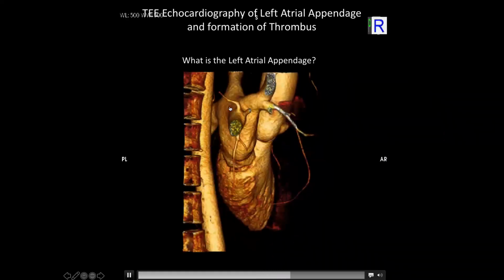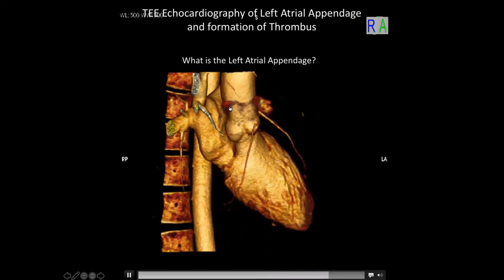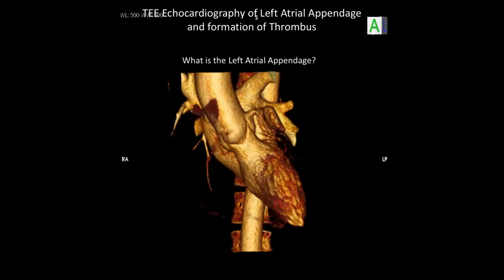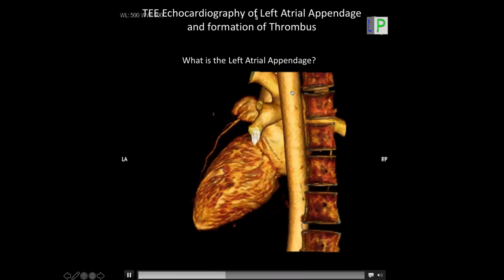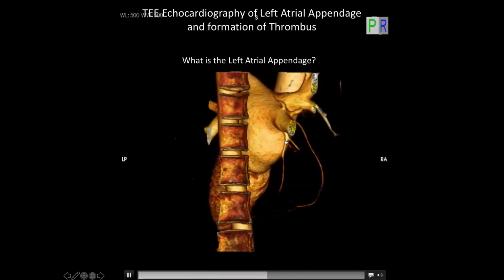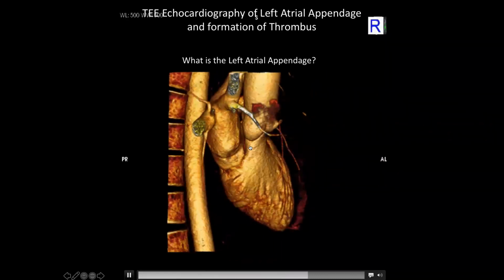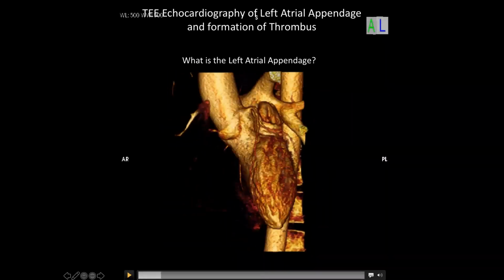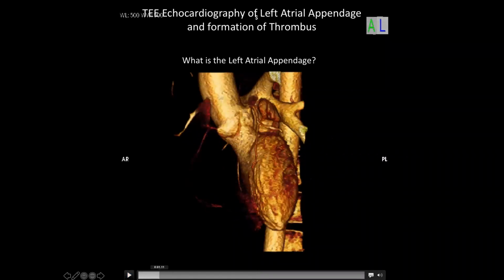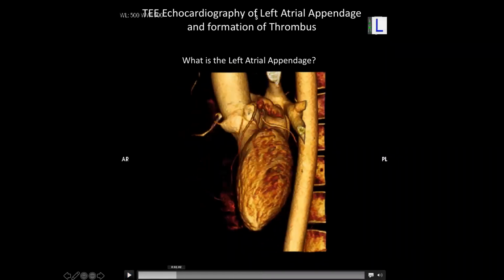So you have the pulmonary veins coming in from the lungs, right? And they are filling the left atrium, which is this big sac above the left ventricle, right? The mitral valve plane is here, easily visualized there. And that gizmo right here is the left atrial appendage. And it's like, well, why are you so interested in the left atrial appendage?